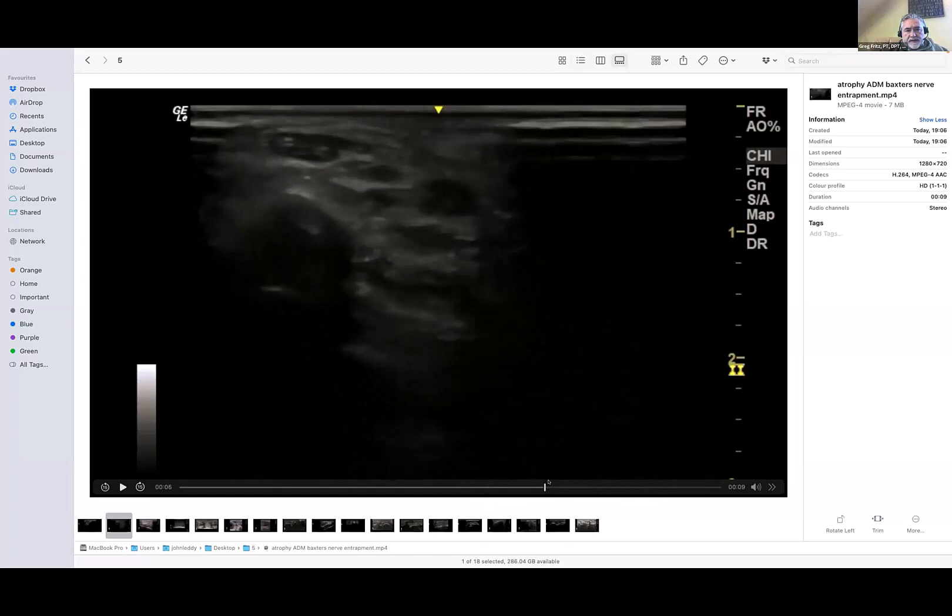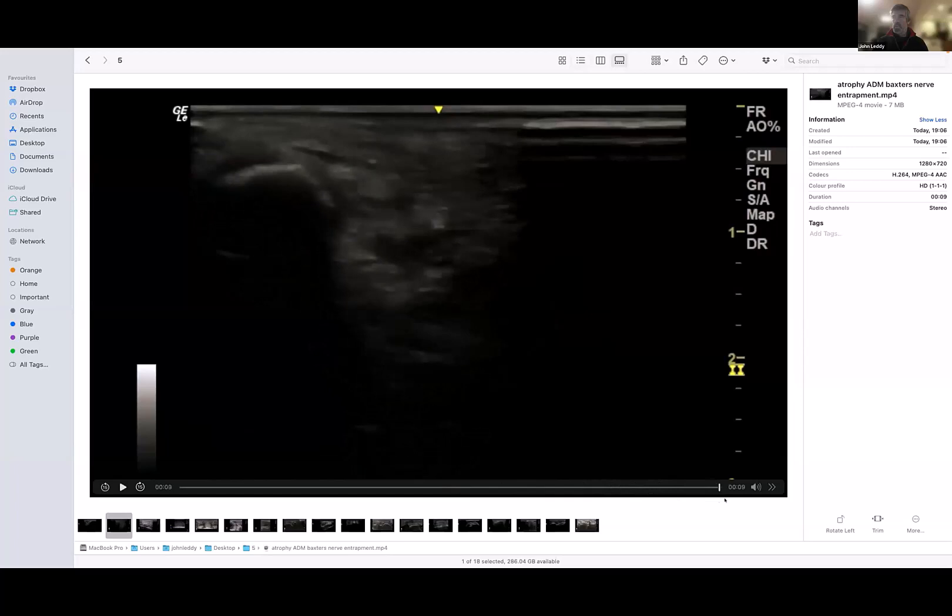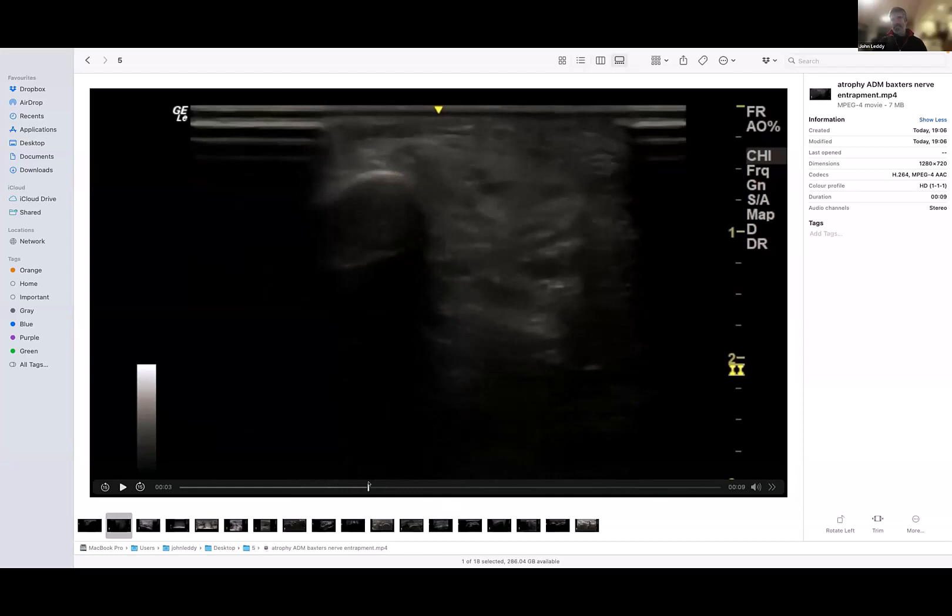That bright tissue is the abductor digiti minimi. So that's a relatively normal-looking one on the contralateral side, and this one is not normal — fatty atrophied. With the muscle next to it atrophied, the fifth metatarsal sticks out anyway, and it looks like a lump.